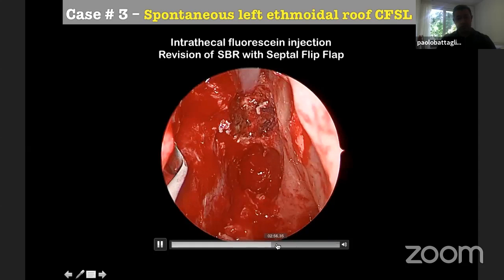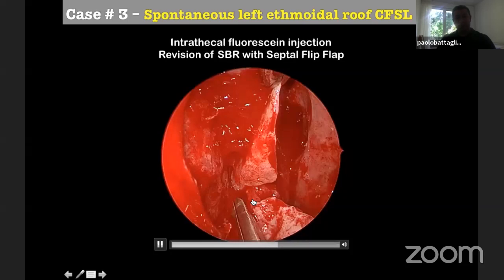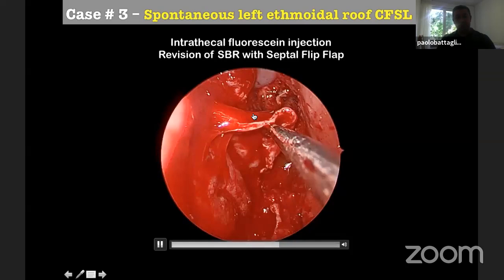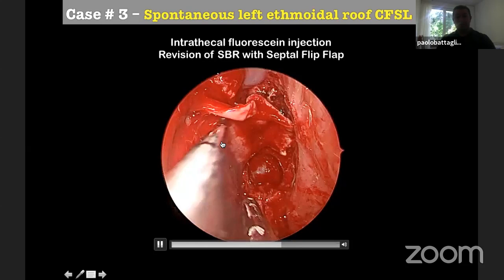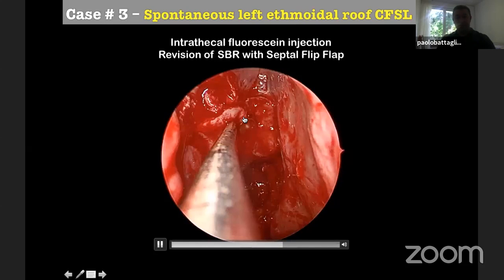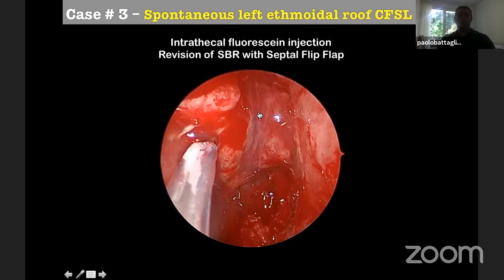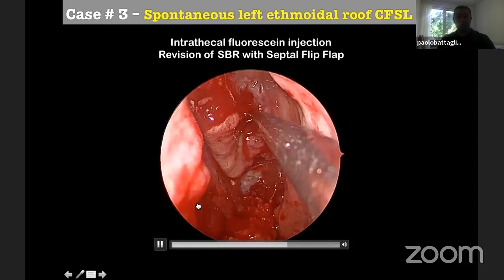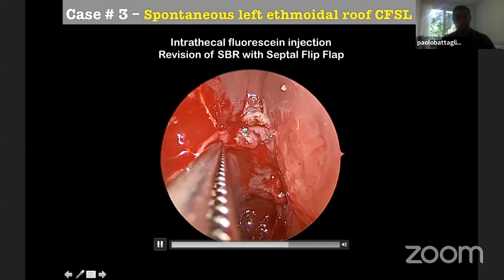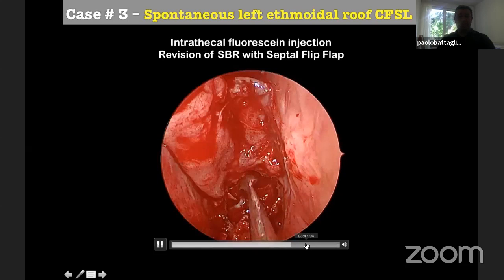So I want to go a little bit faster. Here you see we remove the bone here posteriorly, mucoperiosteum of the right side, and as you can see, we flip here the flap posteriorly. You can modulate also the length. Here it was quite posterior, so you don't need to come too much anterior with your free flap. But as you can see, it covers perfectly the defect.